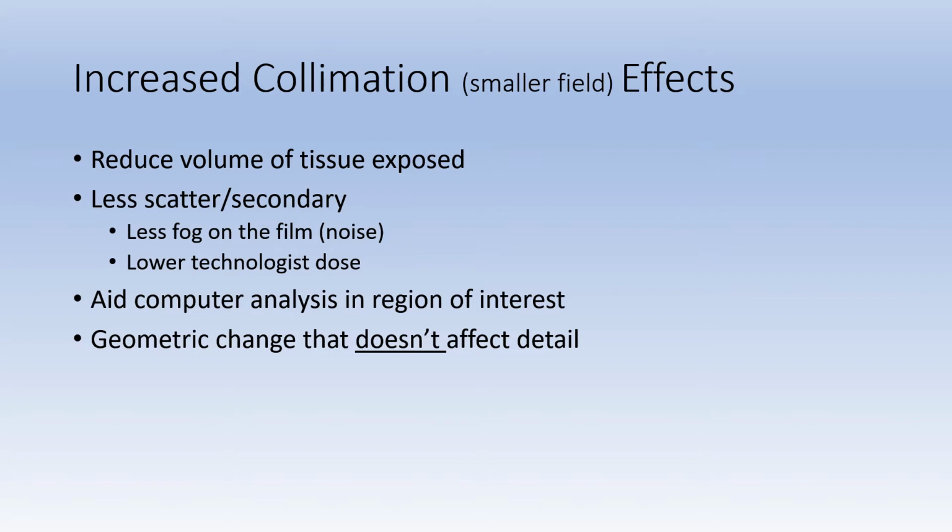Just a word of caution. Collimation is the one geometric change that does not affect detail. Collimation does affect the visibility of small details, a very different thing.